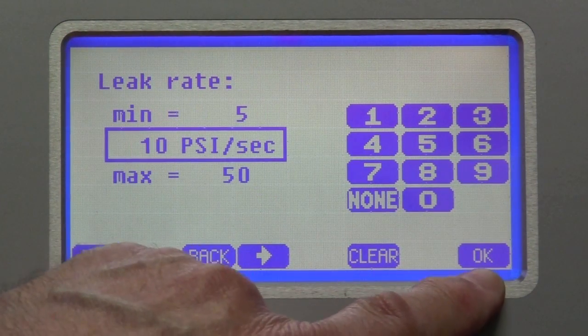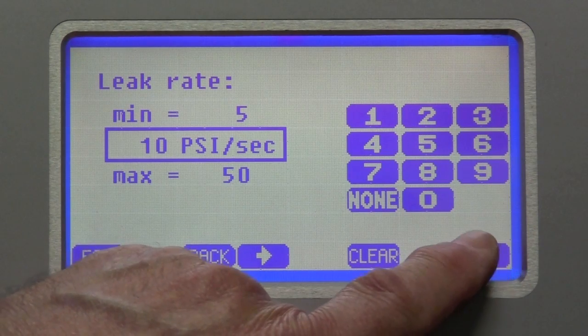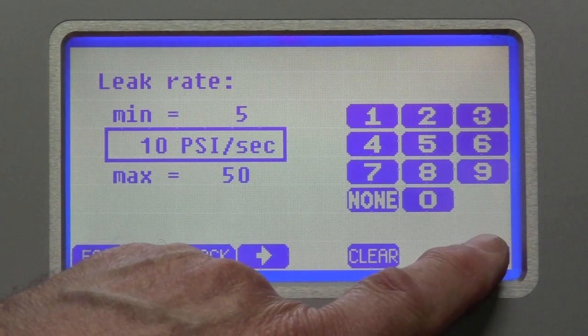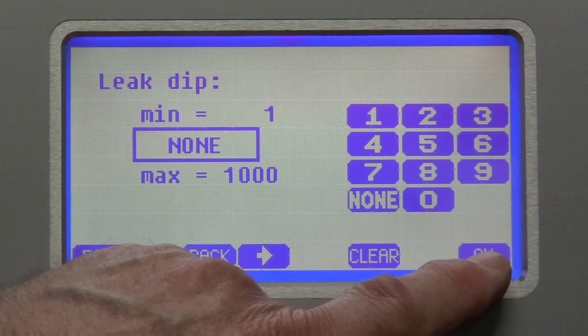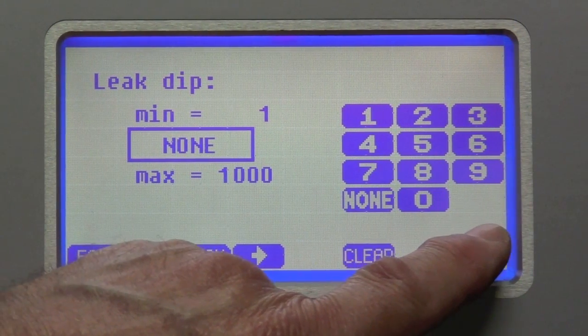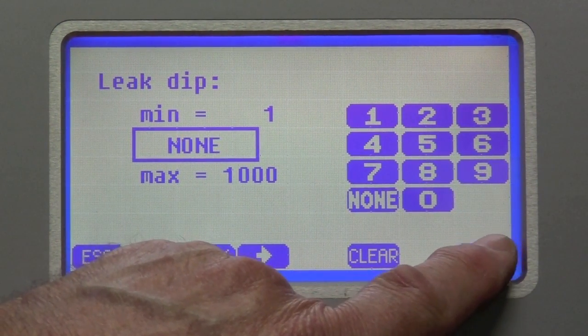Leak rate. We really don't care about that because we're going to burst the product. But I'm going to leave it at its default setting of 10 psi per second. Leak dip is default to none. I'm going to leave it that way.